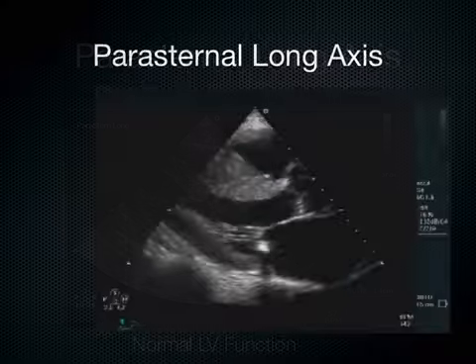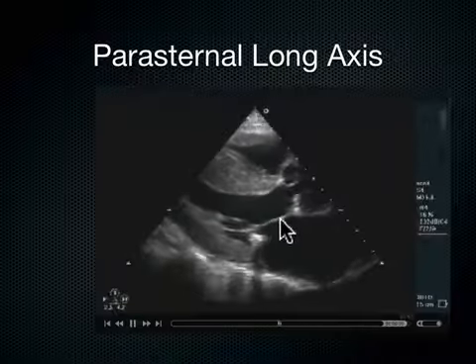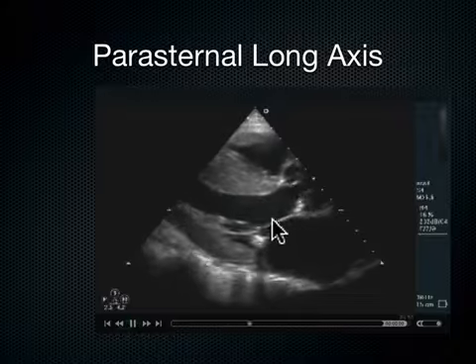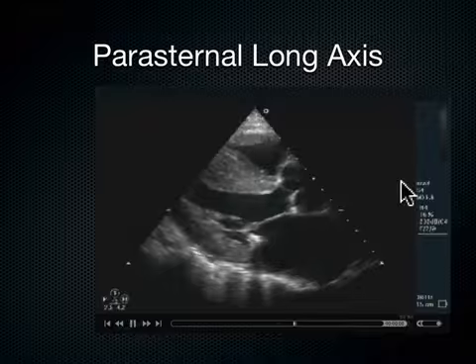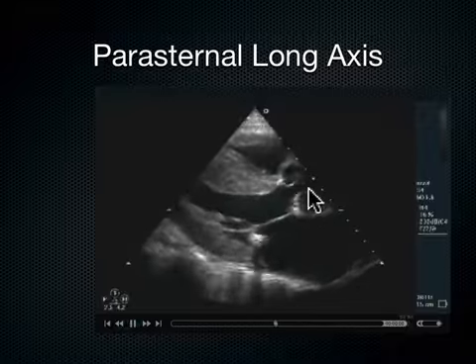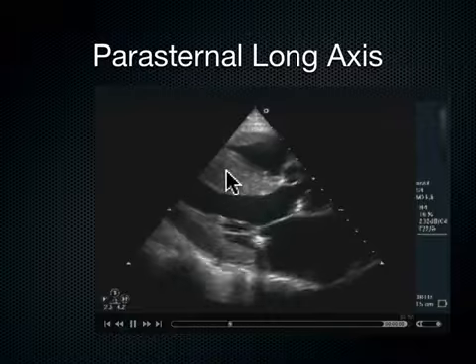Now let's look at another heart and do the same thing. How's that septal leaflet doing? Is it coming up and smacking the interventricular septum? You know what? It gets very close. It's got some good movement. I'm going to say yes. Okay? Is there sequentiality? I don't think so. They seem to both kind of fire at the same time. So I don't see like one then the other. Then I got to move on here.